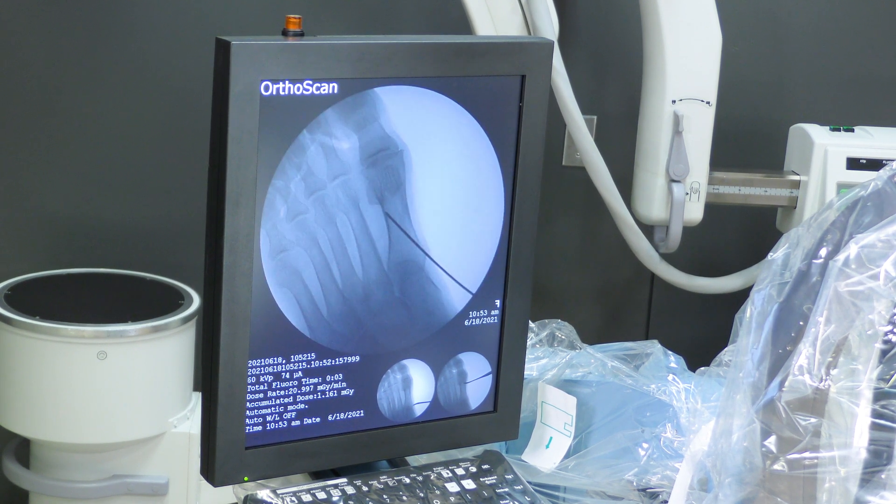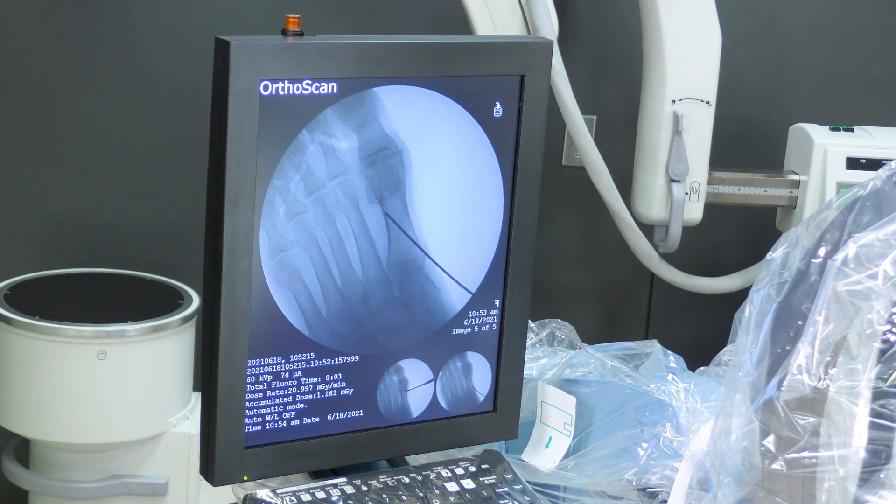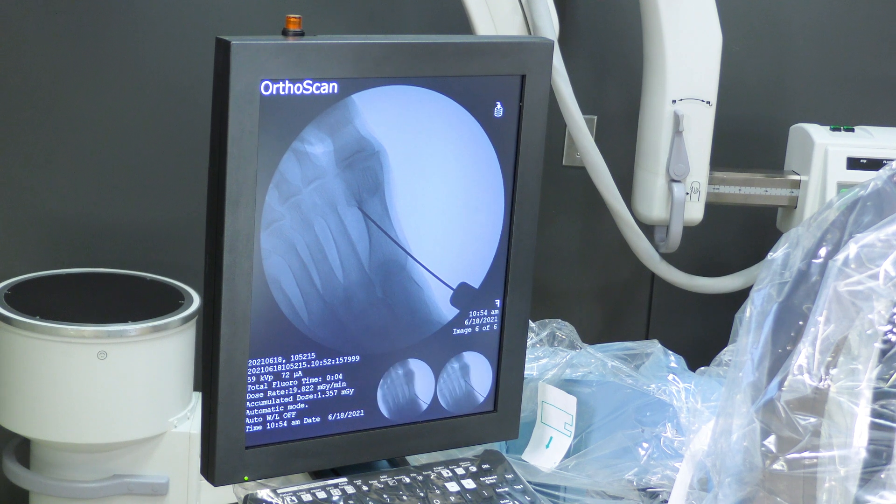Now I'm exiting that lateral cortex — perfect. You can see I'm just out of the cortex and I want to be right where my planned incision is, which is just proximal to the sesamoid. That looks good; I'll withdraw it just slightly.